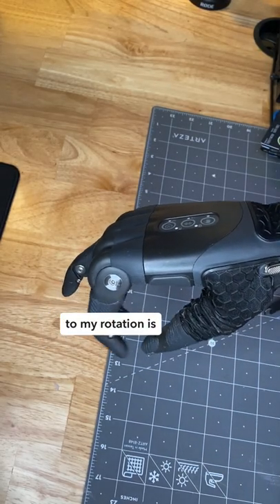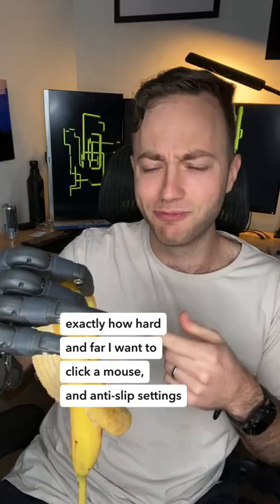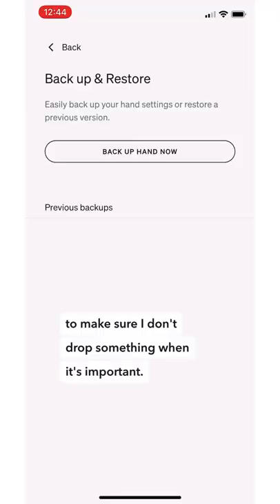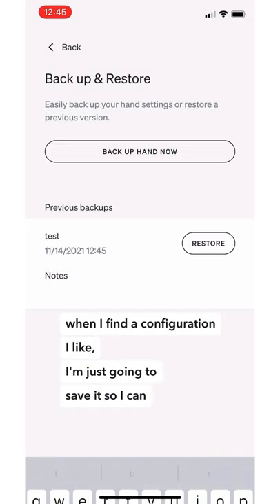Adding new grips to my rotation is pretty much instantaneous. There are fine-tuned parameters for adjusting exactly how hard and far I want to click a mouse, or anti-slip settings to make sure I don't drop something when it's important. And when I find a configuration I like, I can just save it so I can always go back to it later.